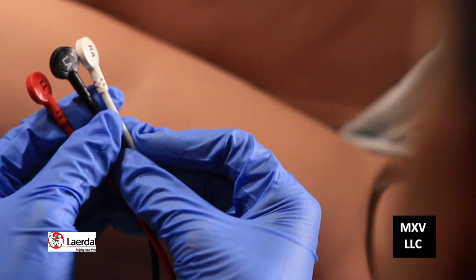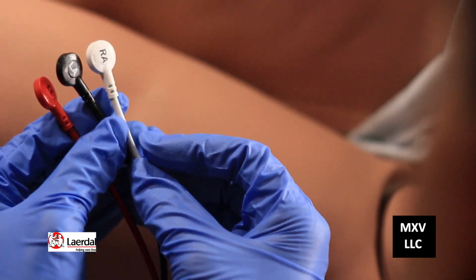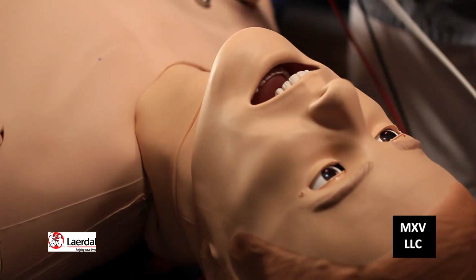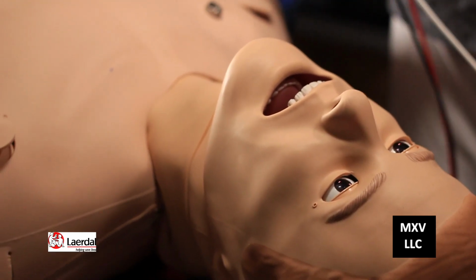Hi, my name is Rebecca. I'm the instructor, and this is Holly. She's a student, and we're going to demonstrate a 3-lead EKG on a patient with an acute myocardial infarction. Okay, Holly, go ahead and introduce yourself to the patient. Mr. Zebra, my name's Holly, and I'm a student, and this is my instructor, Rebecca. How are you feeling today? I feel like an elephant on my chest. All right, don't worry, we're going to take care of you.